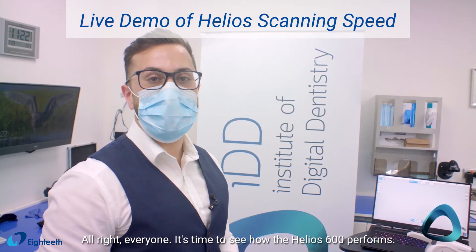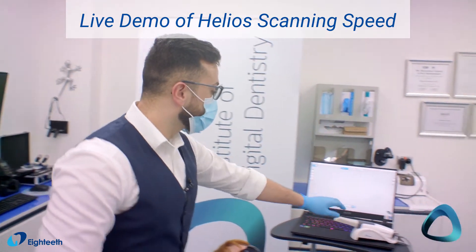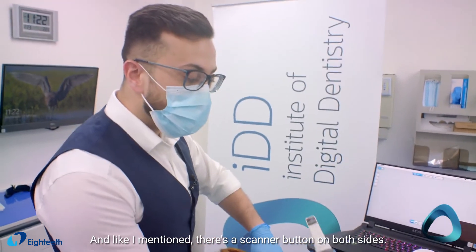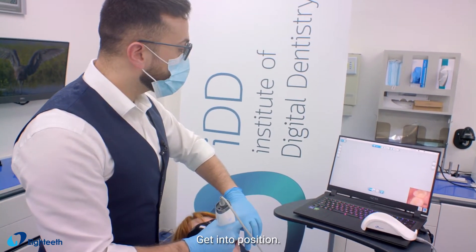All right everyone, it's time to see how the Helios 600 performs. Let's carry out a full arch scan. As I mentioned, there's a scanner button on both sides — get it into position.